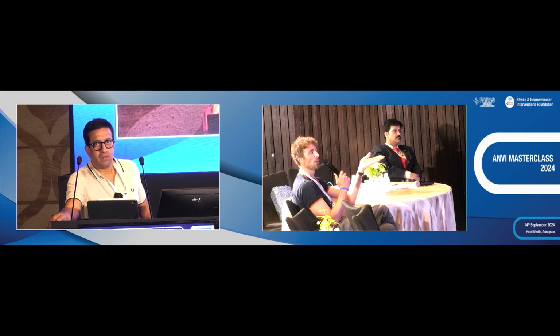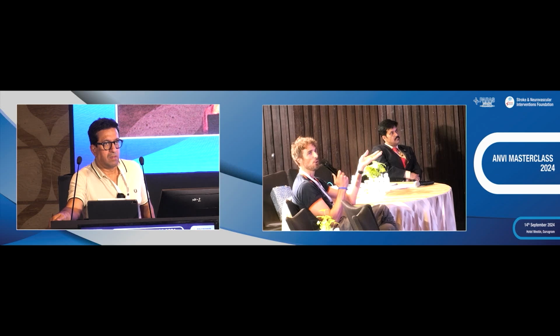So then I just look. Since the last 7 years, I never did any 2D measurement on angio for sizing in intrasaccular, just on the computer. And then I select according to that. And then the rate of change of WEB per procedure is 1.02, meaning that we almost never change the WEB during the procedure. And I do the same now with the Contour. I size with the software.